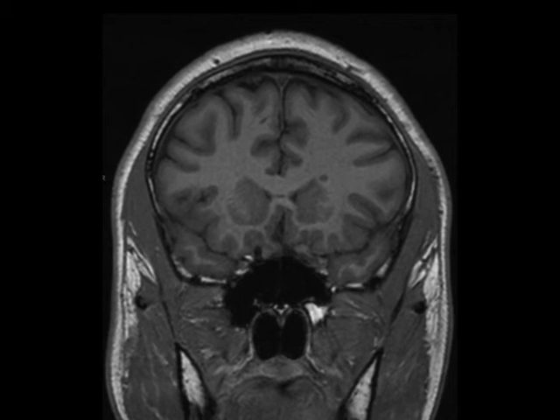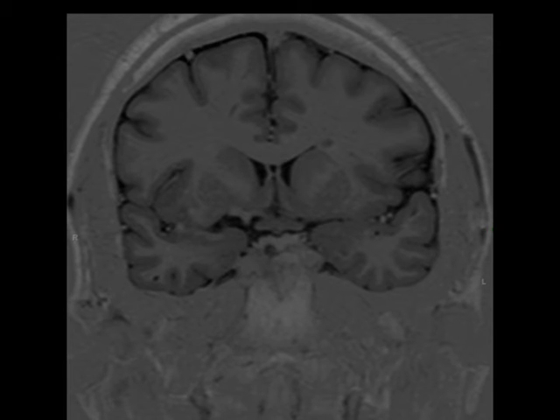33-year-old male with a history of recurrent seizures. The coronal T1 and inversion recovery sequences demonstrate an ovoid focus within the periventricular white matter of the left frontal horn, which is hypo-intense to surrounding white matter but iso-intense to cortical gray matter.